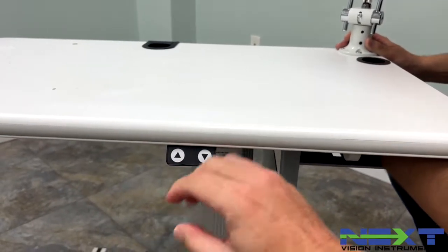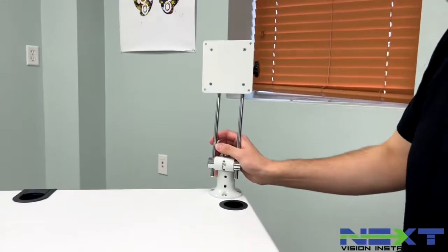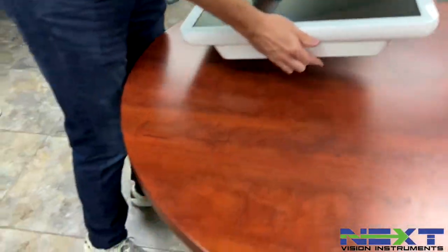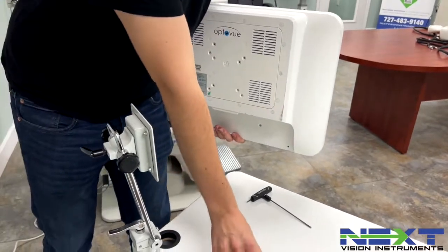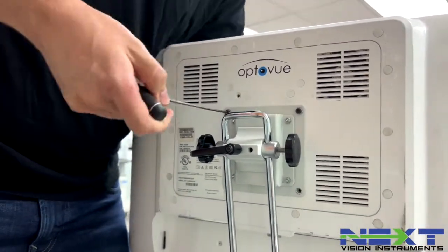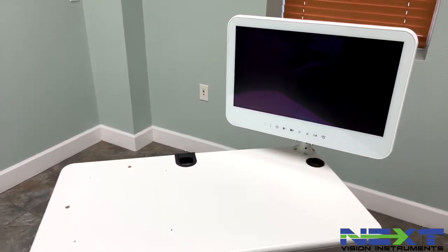This is the operator's right-hand side. You know it's the operator's side of the table because it has the up-down controls for the table, and it's the right side because the operator of the camera will be on this side. Now that it's fastened down and connected to the table, grab the all-in-one and the four screws. Use your three-millimeter, line up the bracket with these four points in the back, and once you have all four tightened, your all-in-one PC is connected and ready to go.